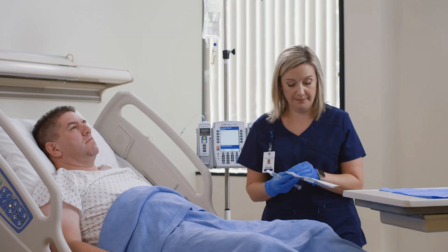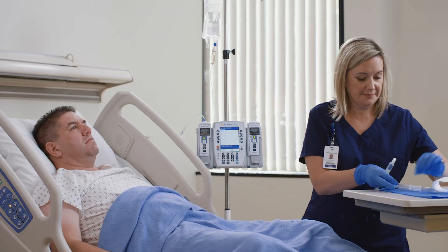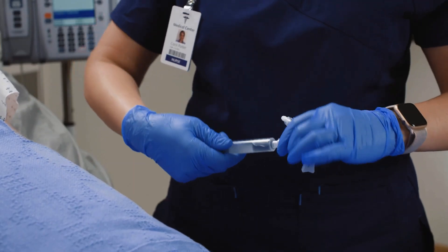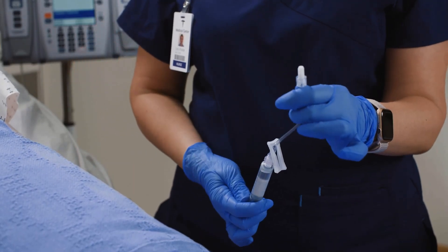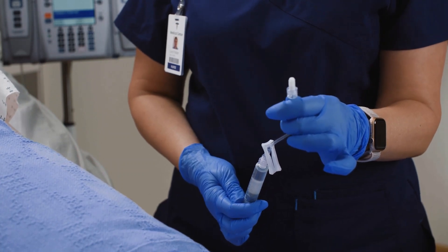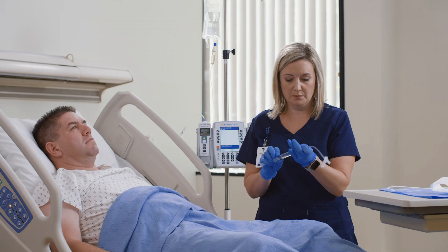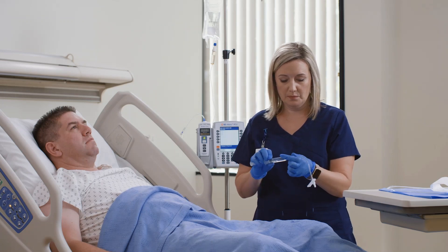To begin, remove the device from the package and connect a pre-filled saline syringe. When connecting to the BD Q-Site device, always insert the lure end by using a straight-on approach. Angled insertions may cause poor functioning or damage to the device. Prime the device per your facility's policy and ensure that air has been purged from the connector or extension set.